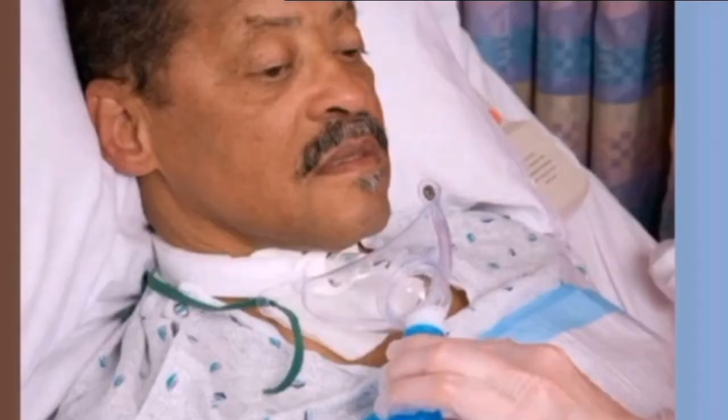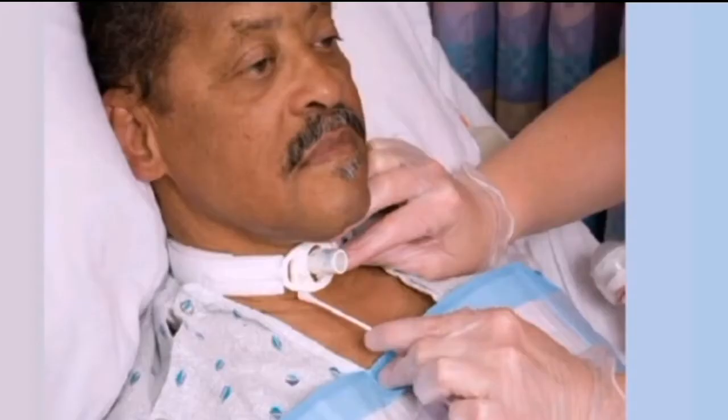And then put on disposable gloves. Remove the oxygen source if one is present. Stabilize the outer cannula and faceplate of the tracheostomy with your non-dominant hand. Grasp the locking mechanism of the inner cannula with your dominant hand. Press the tabs and release the lock. Gently remove the inner cannula and place it in the disposable bag. If not already removed, remove the site dressing and dispose of it, discard the gloves, and put on sterile gloves.